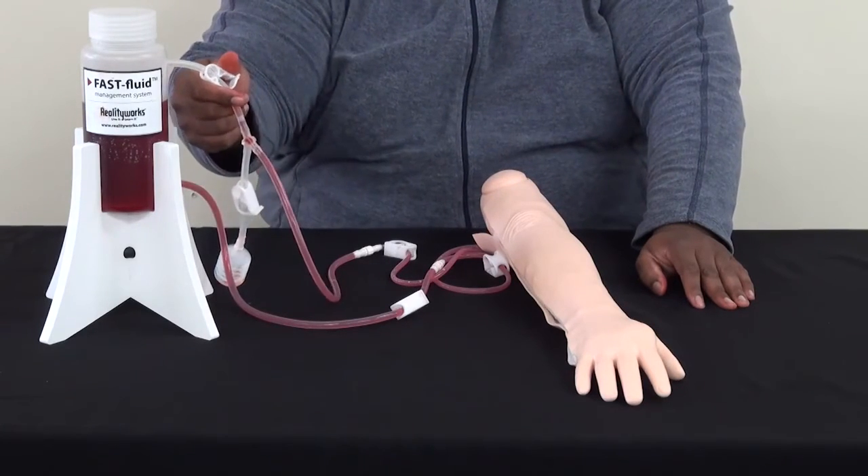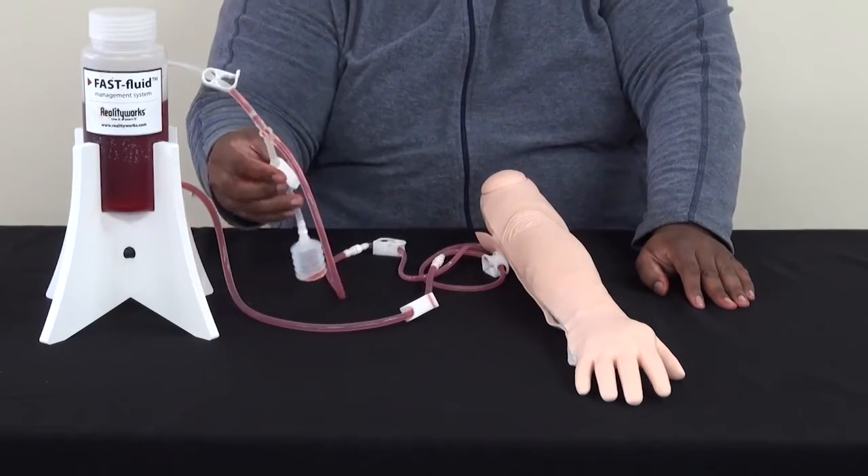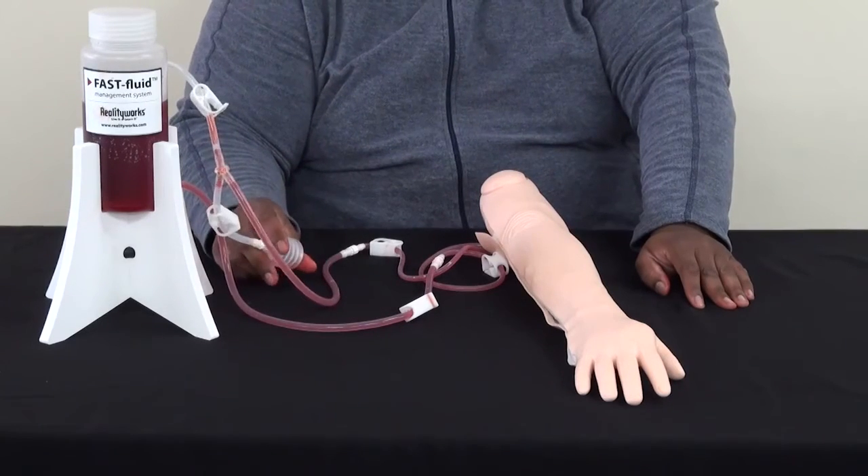After that, you can just close the upper and lower clamp on the tower and open the clamp on the pulse bulb, depending on the arm you have, if that's what you're going to need, and then you're ready to go.